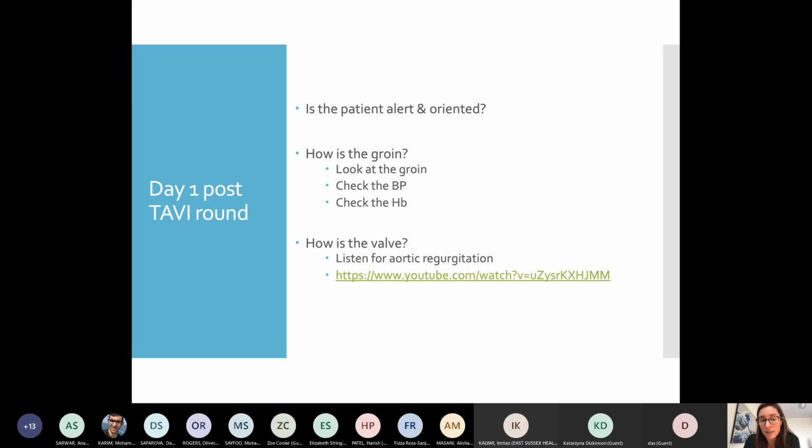How's the valve? So listen to see, can you hear any aortic regurgitation? And again, this is just here to listen to.